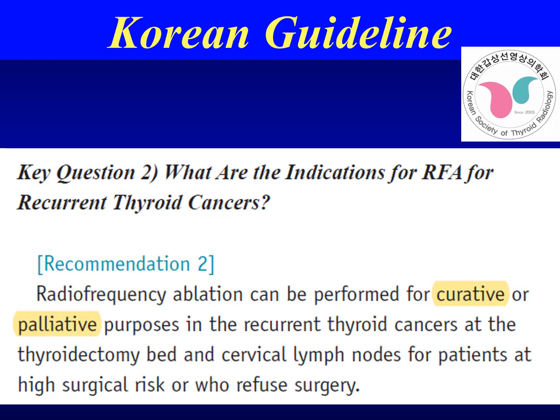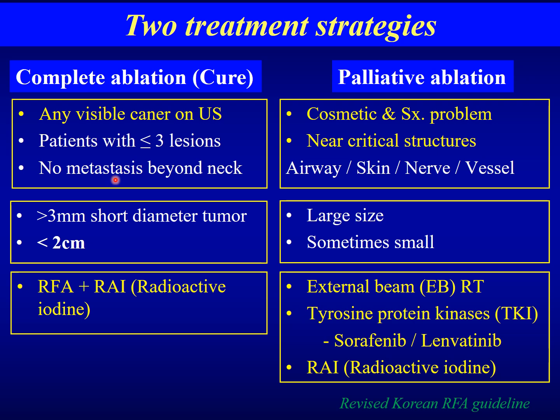Let's move on to recurrent thyroid cancer. Korean guidelines suggest 2 indications for recurrent thyroid cancers. One is cure, the other is palliative. Cure means we treat any visible cancers on ultrasound, and the guideline recommends a combination of RF ablation and radioactive iodine therapy to increase complete treatment.